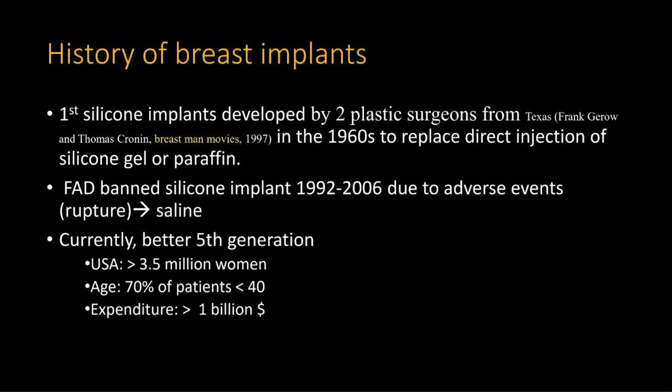In the United States alone, more than 3.5 million women have a breast implant. Most of them are very young. 70% of the patients are less than 40 years old. And there is big money involved in this.